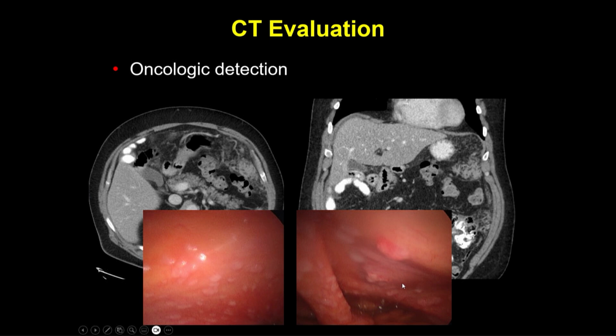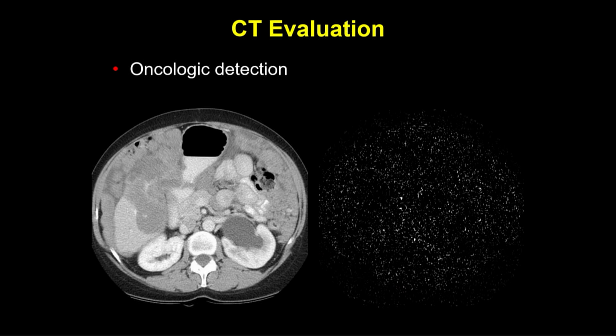We're going to miss some of these sub-centimeter little early deposits. But if we're lucky enough, we'll be able to see just enough to make the diagnosis. But admittedly, there's no imaging technique that's sensitive enough for the sub-centimeter lesions in general. So we do the best we can, and CT is pretty good, but it's far from perfect.